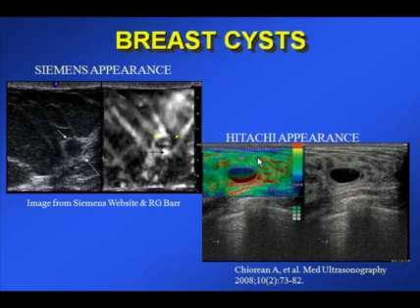Breast cysts, as I mentioned, may have a characteristic pattern within them, and this is caused by decorrelation of the echoes inside. Most elastography systems where they estimate strain use a cross-correlation function to determine how much tissue displacement there is. This presumes that the material that is being compressed is solid. Well, since the material in a cyst is not solid, but rather fluid, the algorithm breaks down, and various types of software handle this breakdown in the algorithm differently.